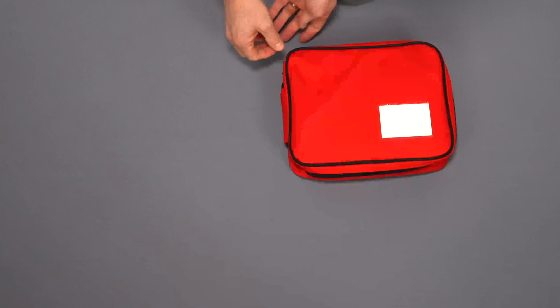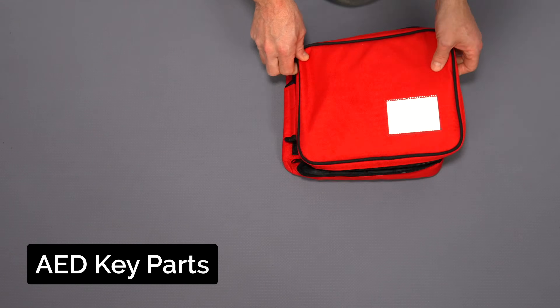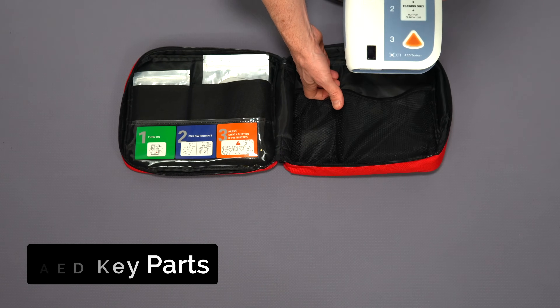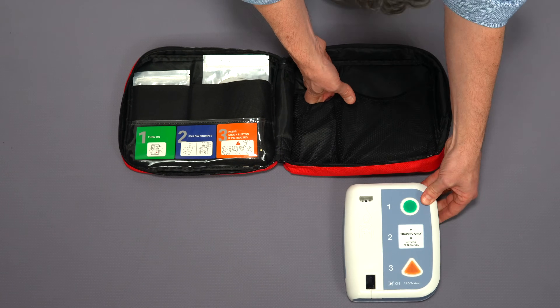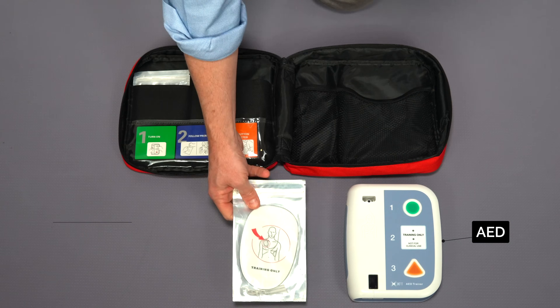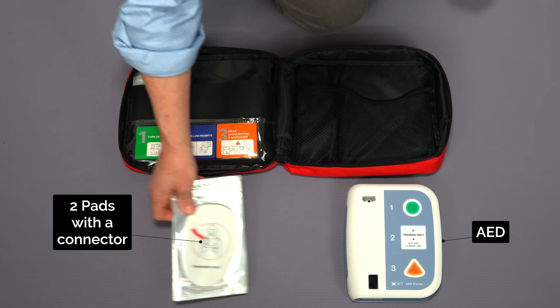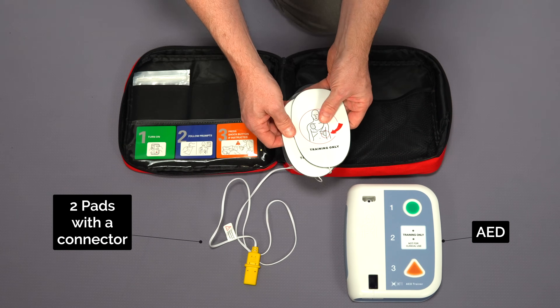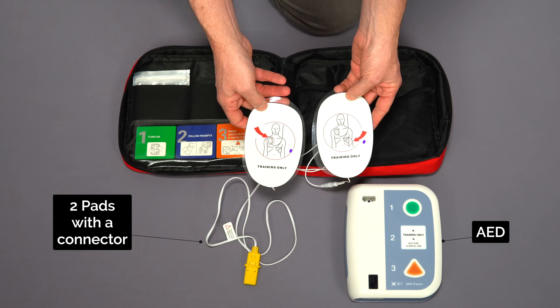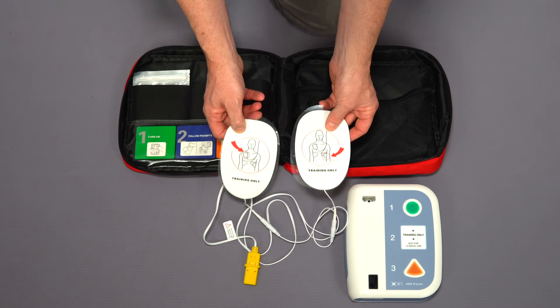When you have your defibrillator, inside there'll be the defibrillator itself and some pads in a foil packet. When you open the foil packet there'll be a lead for two pads, which will demonstrate where they should be placed on the chest.